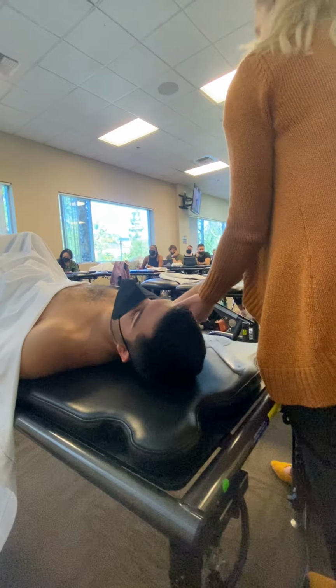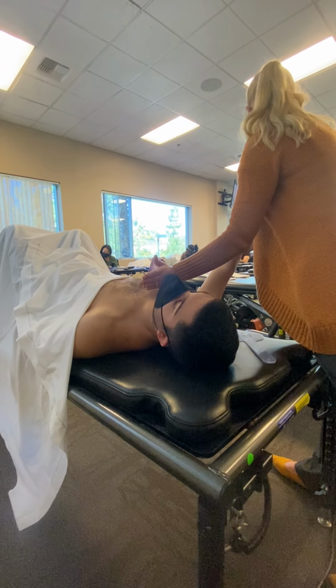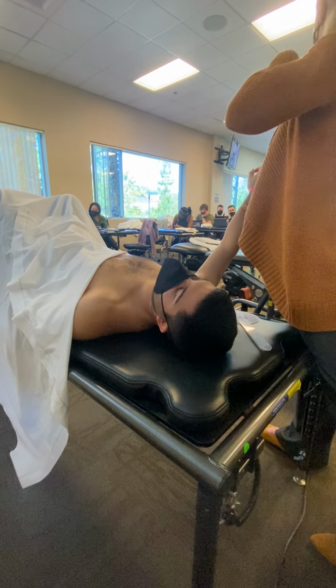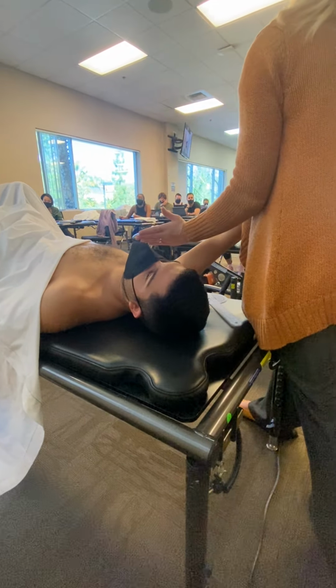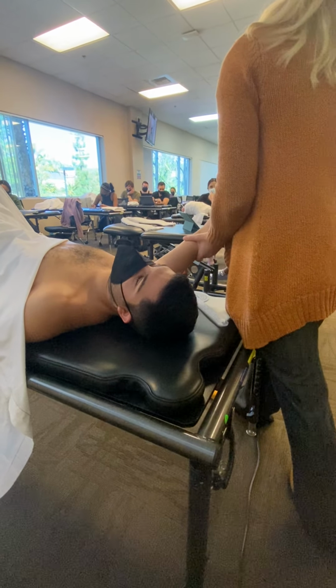This is for the clavicular. Sternal. So clavicular is 90, sternal, 135. So you want to think the opposite of the way that those muscle fibers are running. The clavicular runs parallel with the clavicle. Sternal kind of runs at that angle with the sternum. So now those fibers are lined up with the sternum. Did you externally rotate for the sternum? Yeah, sorry, forgot to mention that.